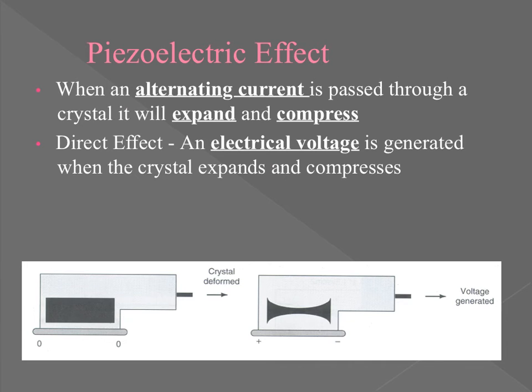The piezoelectric effect. Now, we can look at an ultrasound head and we can say, okay, this is an ultrasound head when the device is off, okay? Then we push the on button. We're not talking about starting the ultrasound treatment. We're just turning on the device. We're turning on the box, pushing the power button on the back of the actual unit. What we know about the piezoelectric effect is this.